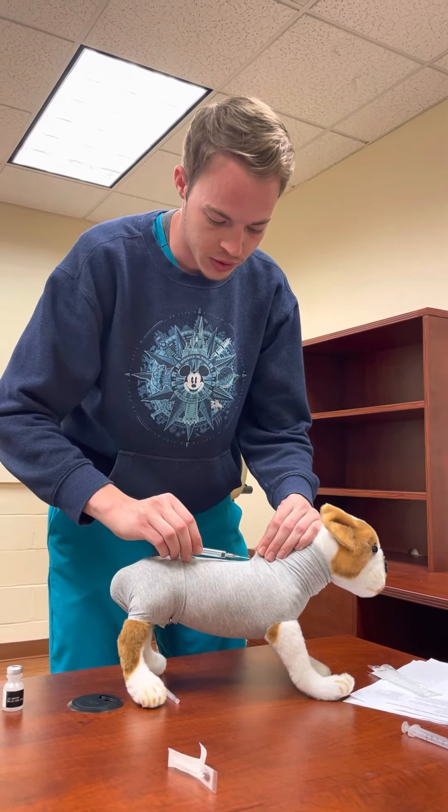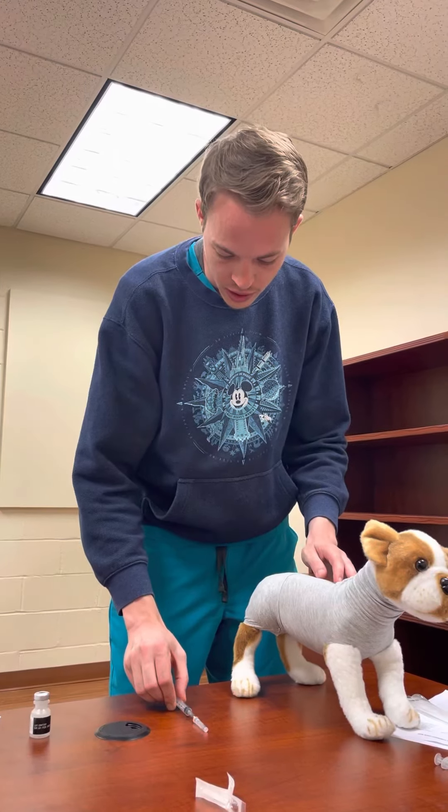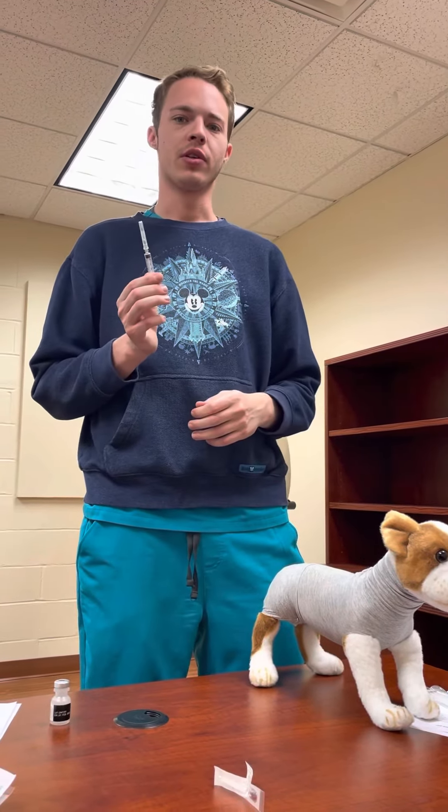After we're done, we're going to pull the needle out, and we want to recap it using the one-hand scoop technique. Then we would dispose of our needle in the sharps container.